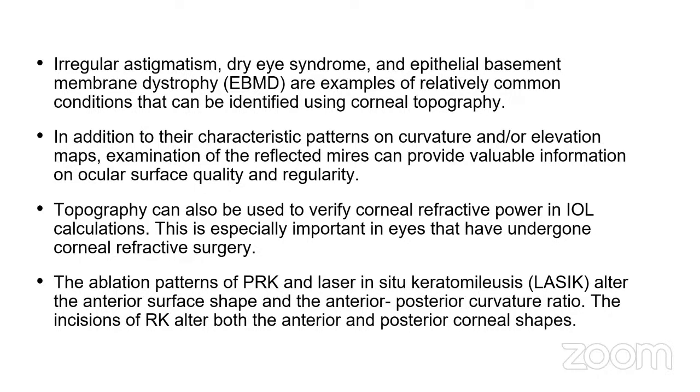Topography can also be used to verify corneal refractive power in IOL calculations. This is especially important in eyes that have undergone corneal refractive surgeries. The ablation patterns of PRK and LASIK alter the anterior surface shape and the anterior-posterior curvature ratio. The incisions of radial keratotomy alter both the anterior as well as posterior corneal shape.